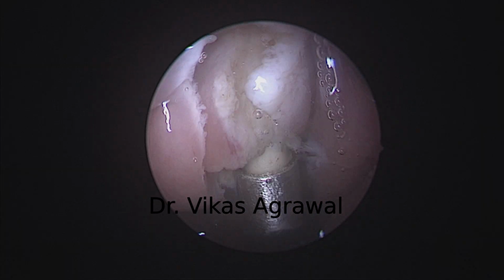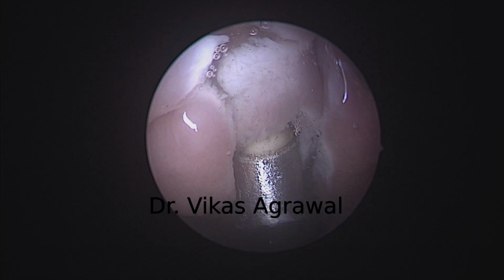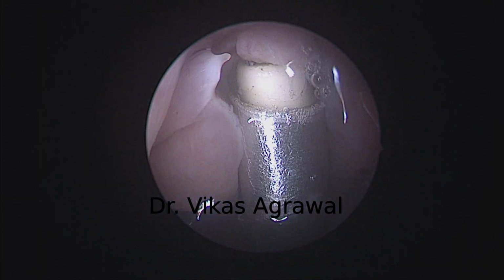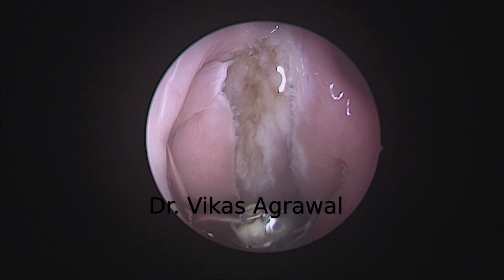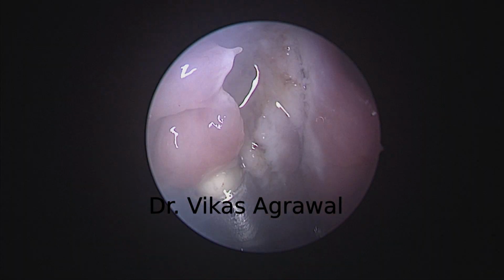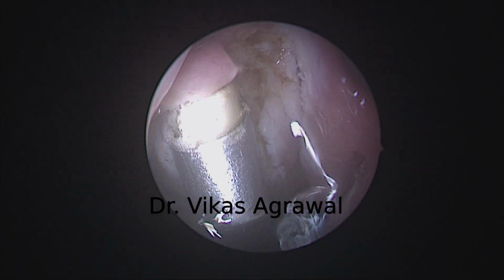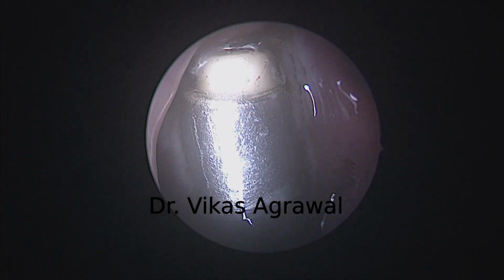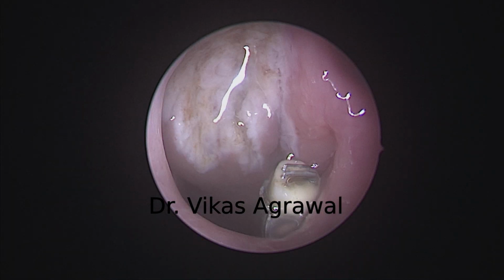Now you can see the endoscope is through the nasal cavity. The plasma wand is through the oral cavity, which is bent by almost 35 to 40 degrees. And at a setting of 9 for ablation and 3 for coagulation, we are melting the adenoid tissues completely. This is the eustachian tube.